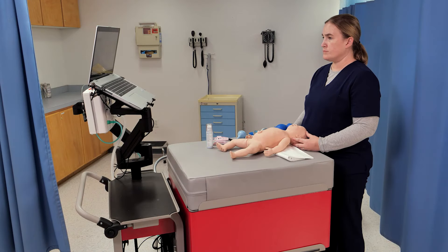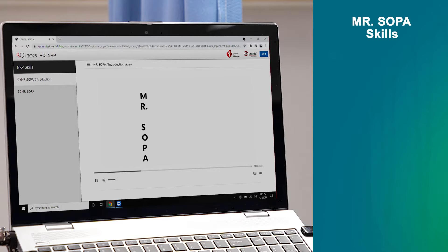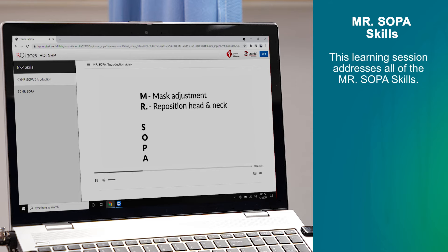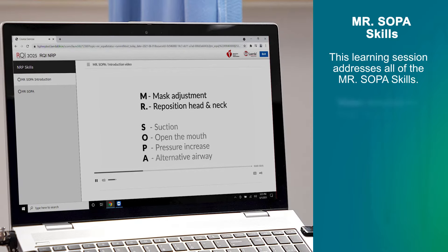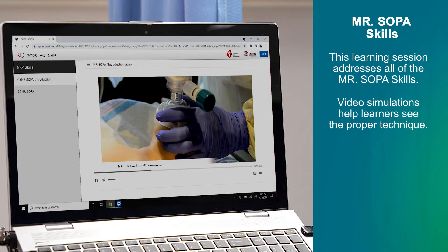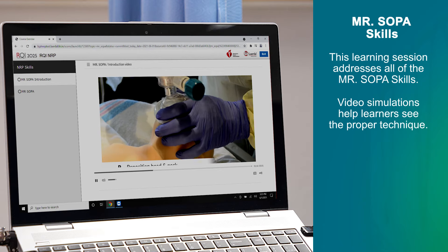Begin MR. SOPA steps. M and R: mask adjustment and head repositioning. Adjust the mask and reposition the head.